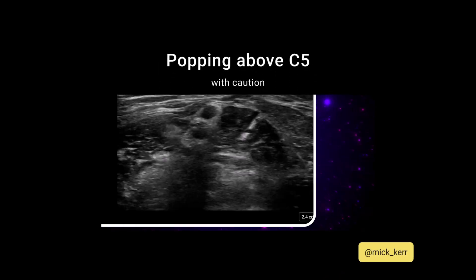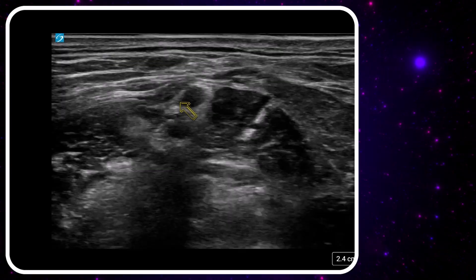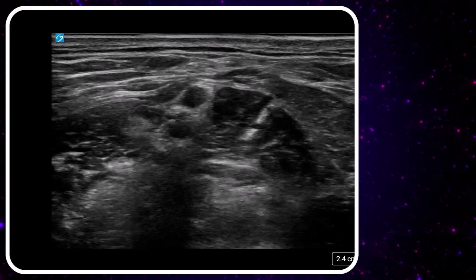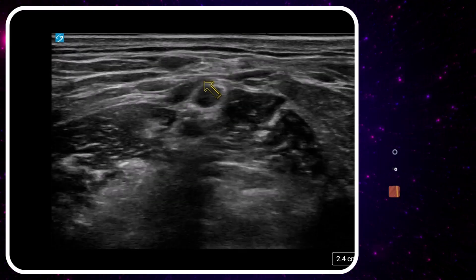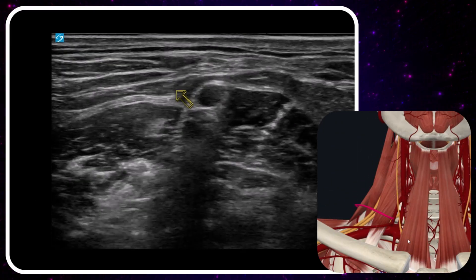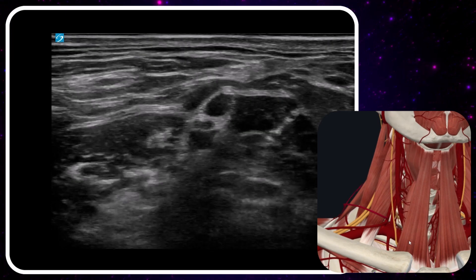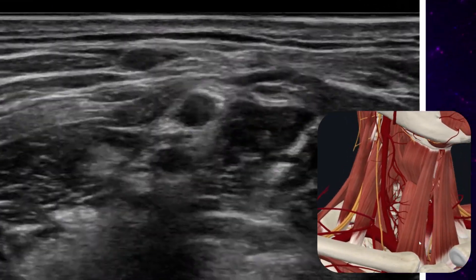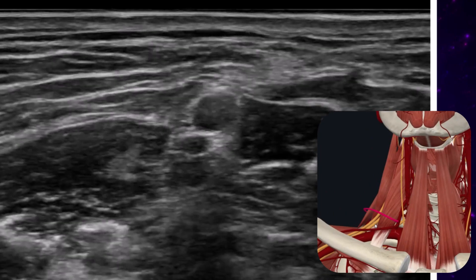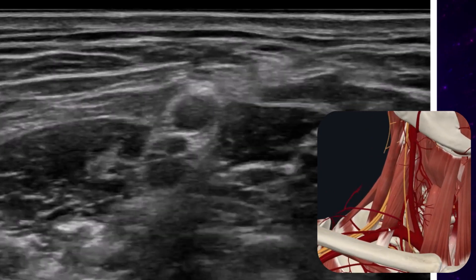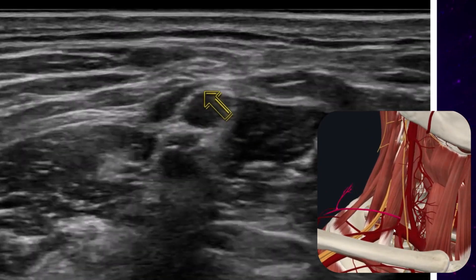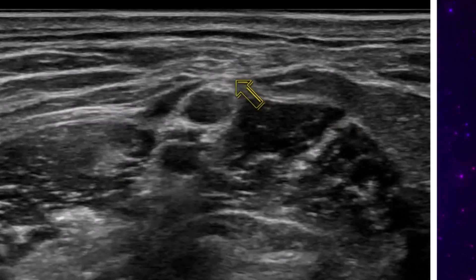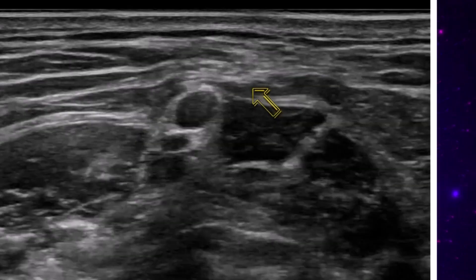We've got a standard interscalene view. We've got C5 here, C6 here. We can see this pulsation — we've got an artery on top, probably the transverse cervical artery. We're just flicking the probe around and following the artery, and we can see it's running on top of C5, above our fascia — the prevertebral fascia.